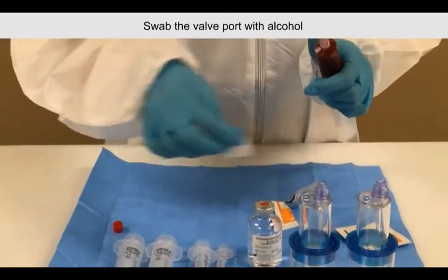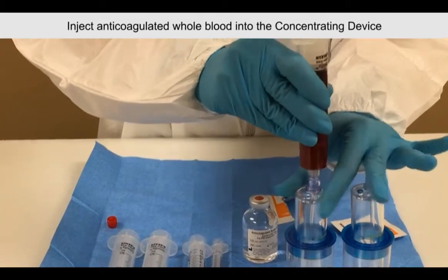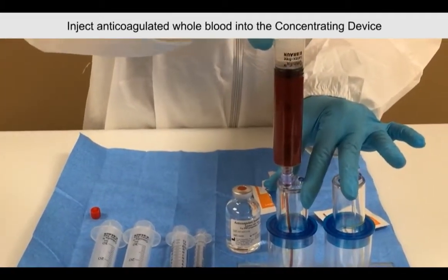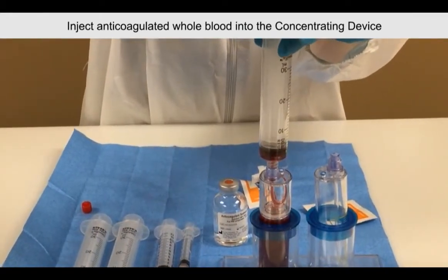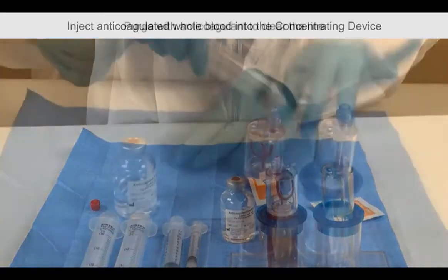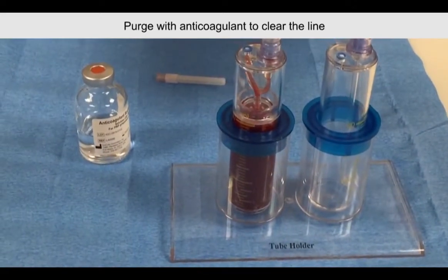Swab the self-sealing port with sterile alcohol and inject anticoagulated whole blood into the concentrating device. You can purge the device with anticoagulant to clear the line.